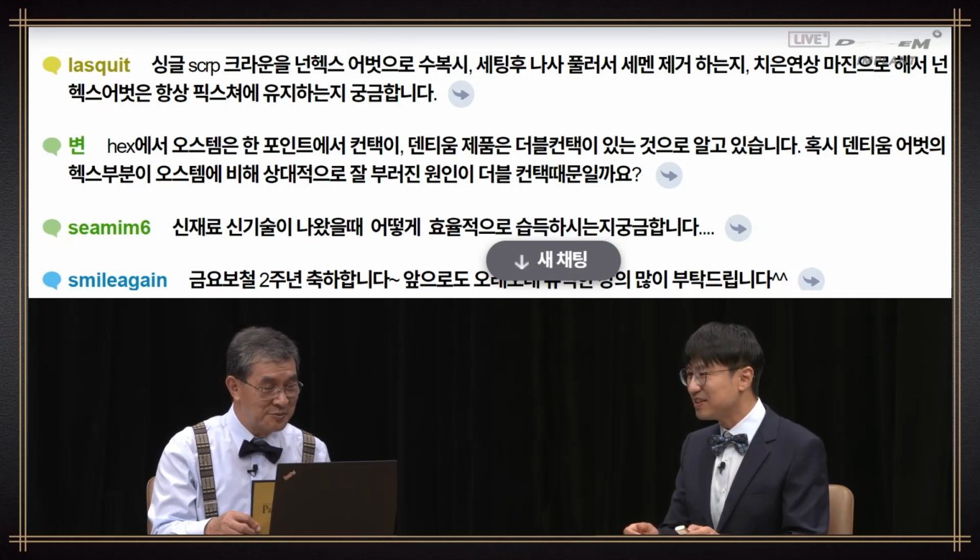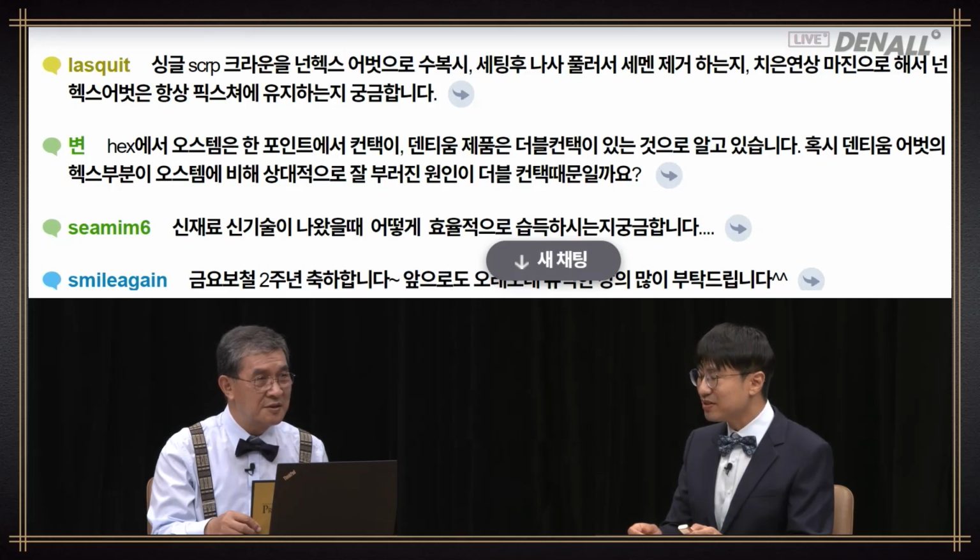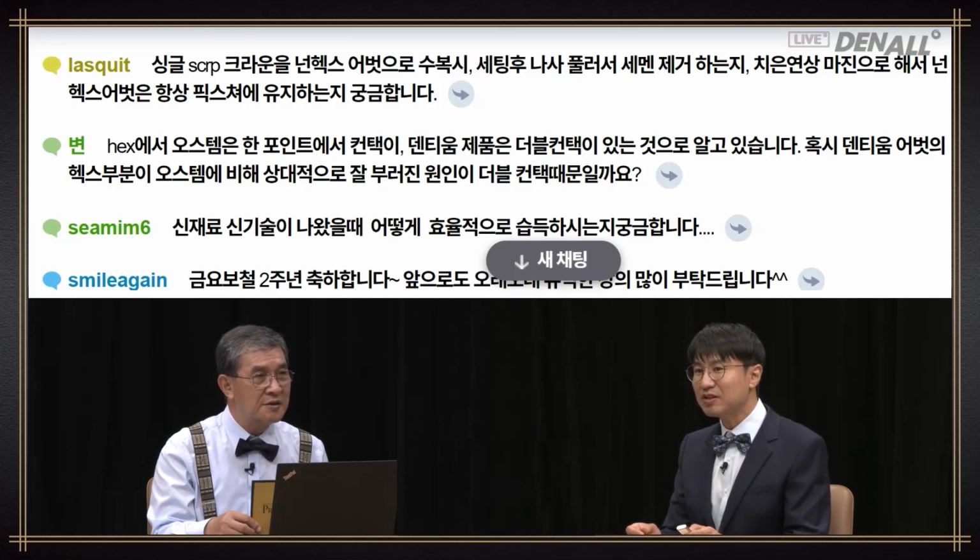In the case of anterior, where cement removal is not easy, if it is single restoration, I would cement it extraorally because contact is not strong and connected like a screw type.